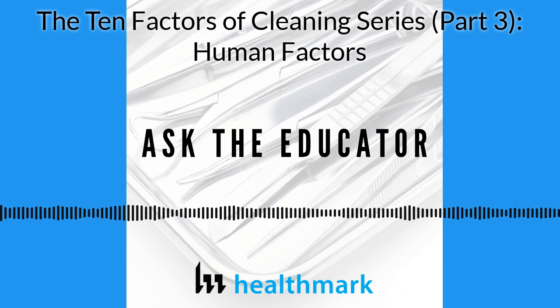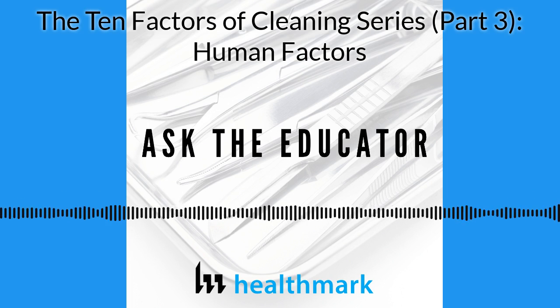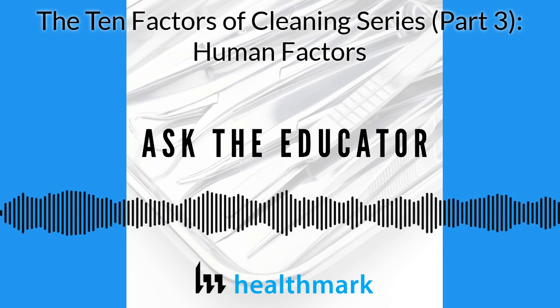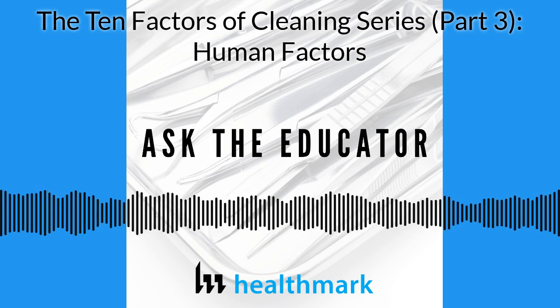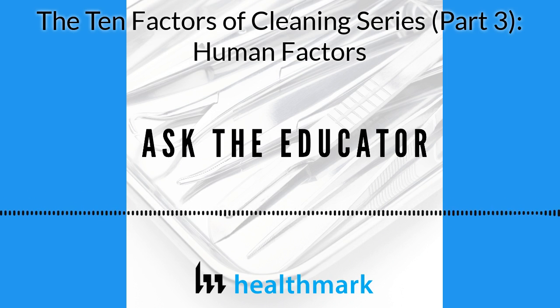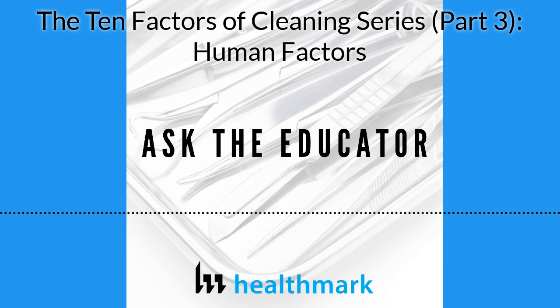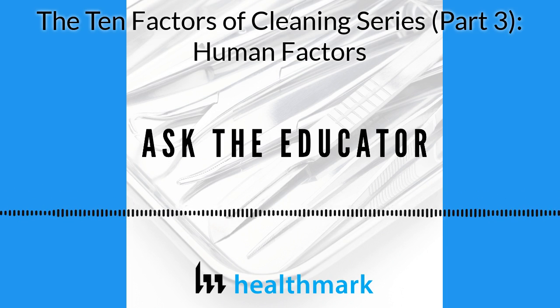The best example I always think of when it comes to training is you might have your automated washer working correctly, or your sonic, and you tested and all these other things are working. And I talk to a manager and they say, let's go into decontam. I go in and I see somebody loading an orthopedic tray with the lid still on it. And right away, that is a training issue.